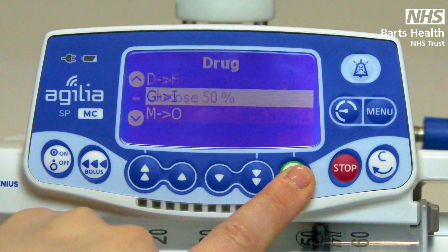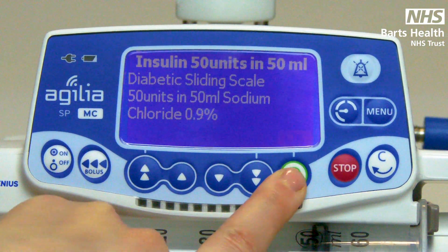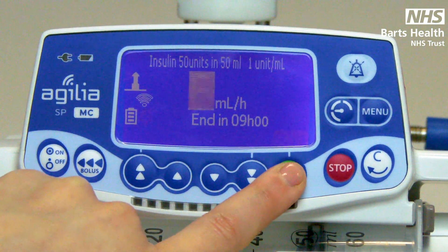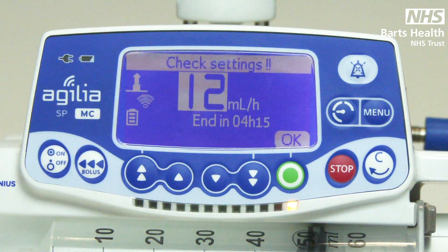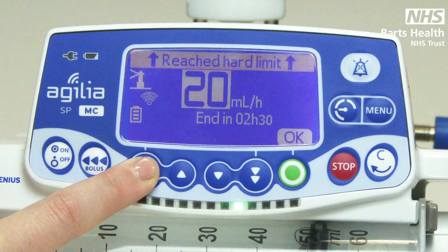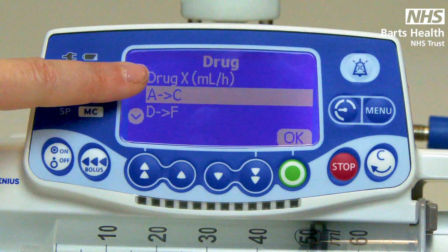The drug library is made by clinicians and pharmacy using dose error reduction software. When using drugs in the library, there are a set of parameters for you to work within — for example, insulin. There are soft limits when the pump will indicate you are running at a high rate, and max limits that you cannot run beyond. The drug library must be used when possible. If the drug you are administering is not there, then you can use Drug X.